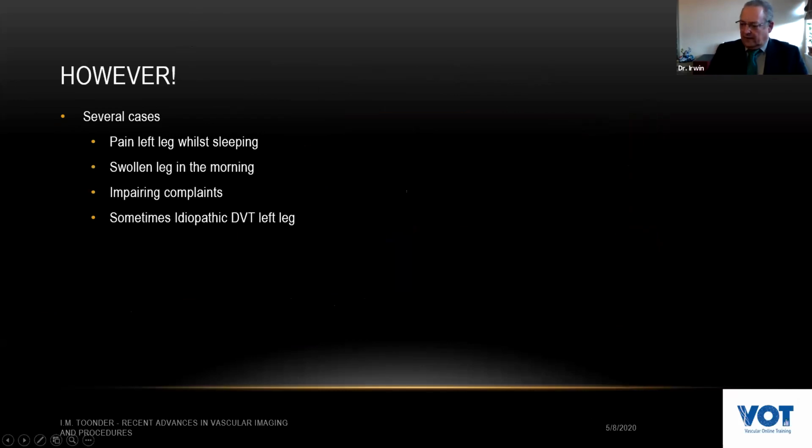However, if we can focus on fibrotic lesions. Having said this, I thought, Eureka, we have found that we should be looking at stenotic lesions with duplex, putting patients upright, and if we don't have these fibrotic pictures, then it's not really a May-Turner.